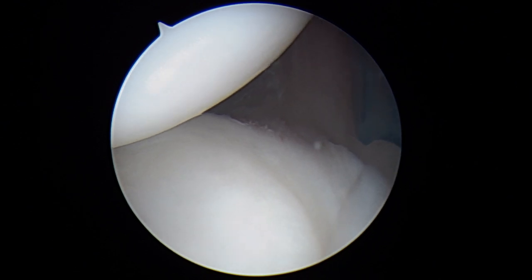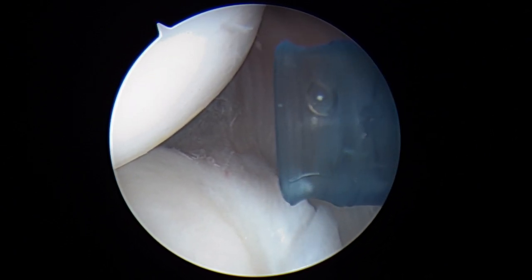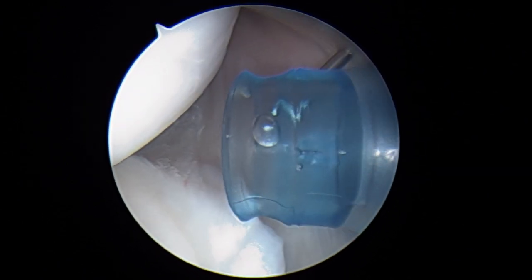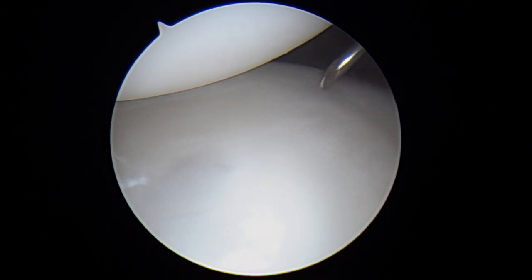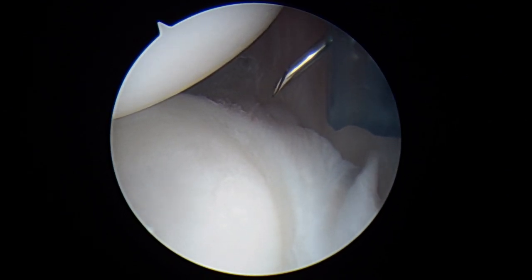Now we'll take a spinal needle and we're going to check our angle here. You can see it looks like we can get a pretty good angle down into the bone right there. And so we'll get to work on that in just a second.